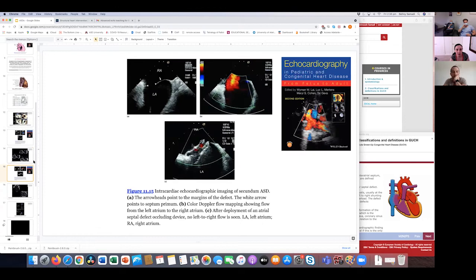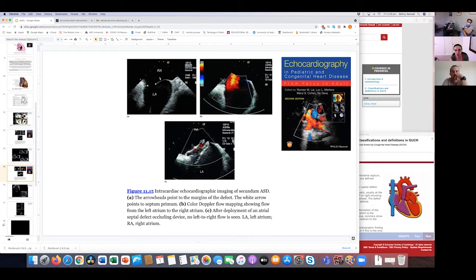Here's an intracardiac echo - we don't typically do these - showing the right atrium, left atrium, and again you can see a secundum ASD there. The shunt direction is going from left atrium to right atrium, and here's the device implant.